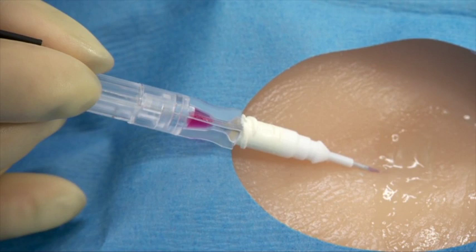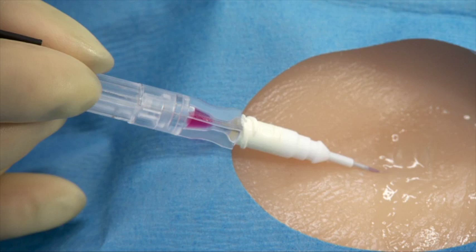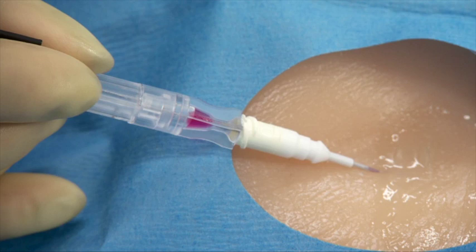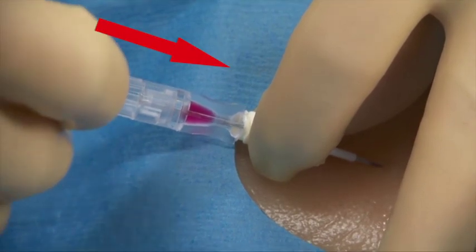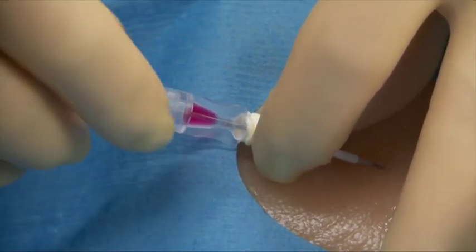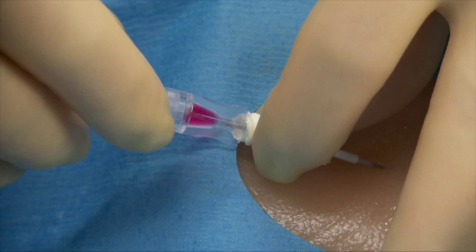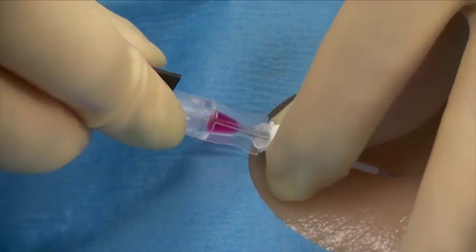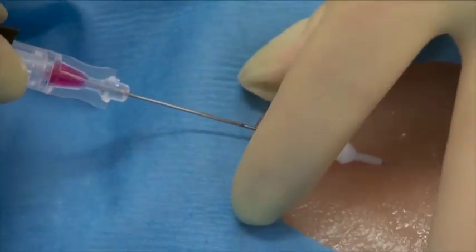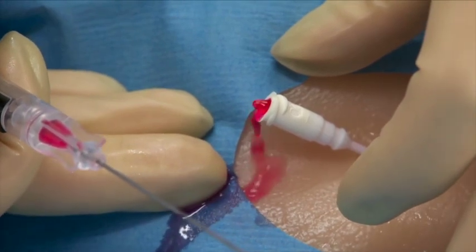Avoid transfixing both walls of the artery. Use of ultrasound can help prevent this. Advance the entire placement device a maximum of one to two millimeters further into the vessel to ensure that the catheter is seated within the vessel. Lower the placement device assembly slightly. Stabilize the position of the introducer needle and carefully attempt to advance the spring wire guide into the vessel using the spring wire guide handle. When the spring wire guide handle reaches the black line on the tube, this indicates that the tip of the spring wire guide is located at the needle tip. Note, if resistance is encountered during spring wire guide advancement, withdraw the entire unit and attempt a new puncture. Advance the catheter forward over the spring wire guide. Hold the catheter in place and remove the spring wire guide assembly. A pulsatile blood flow should be visible at the end of the catheter, indicating a positive arterial placement.